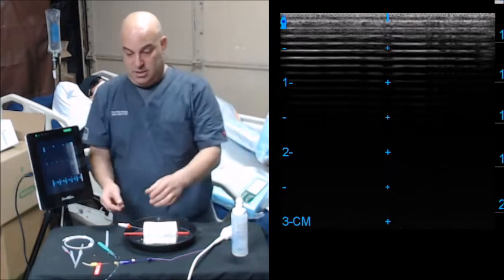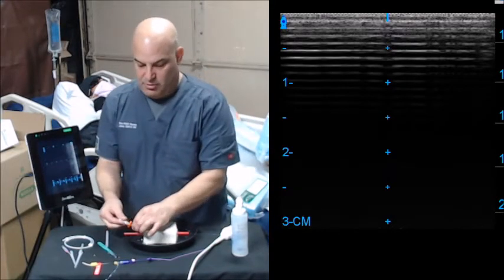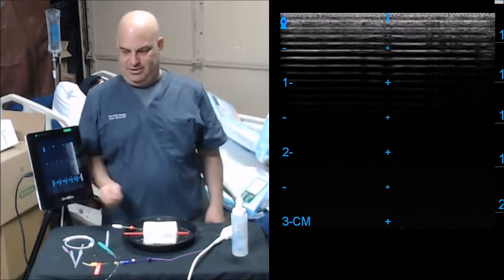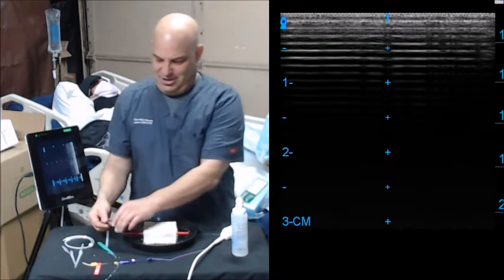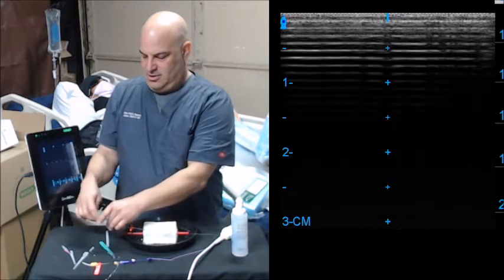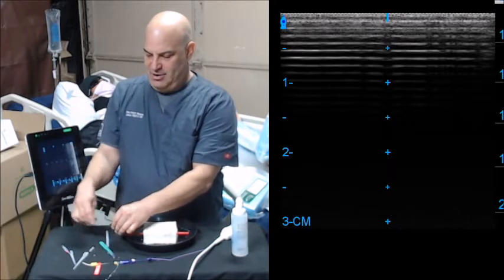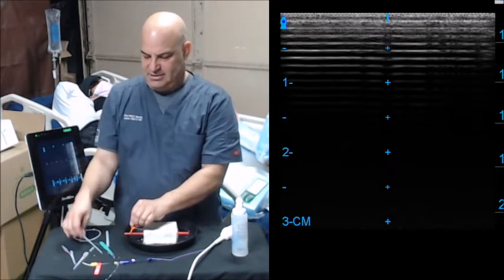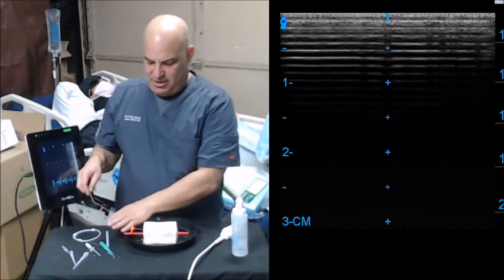Everything else is what you're a nurse for. I mean otherwise you're pulling out the vessel dilator and removing the, you know what I mean. All you're doing is dropping your wire at that point, taking out your vessel dilator and dropping in your catheter.